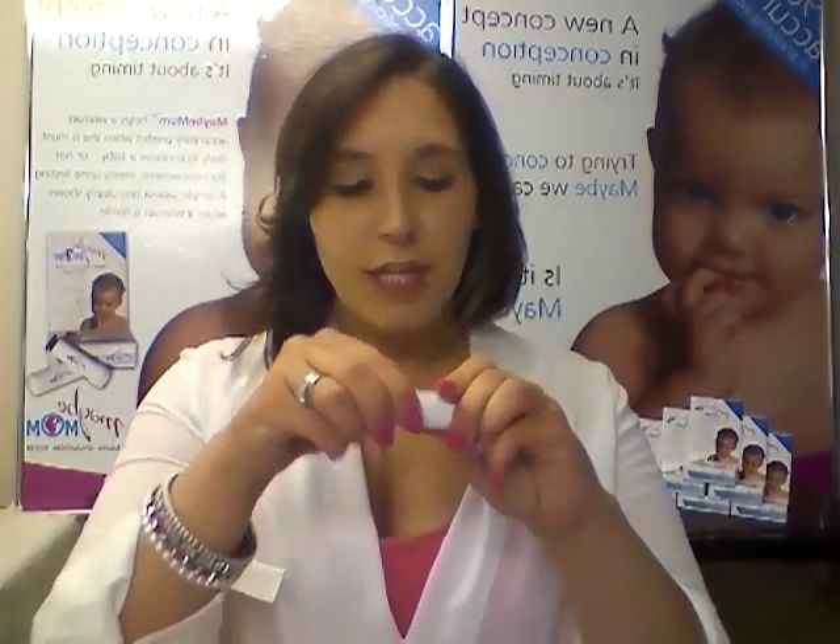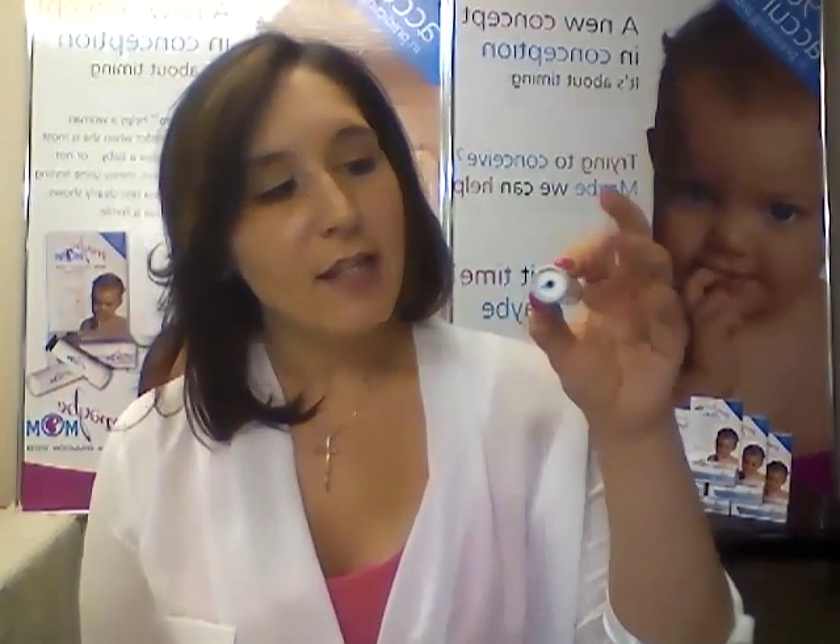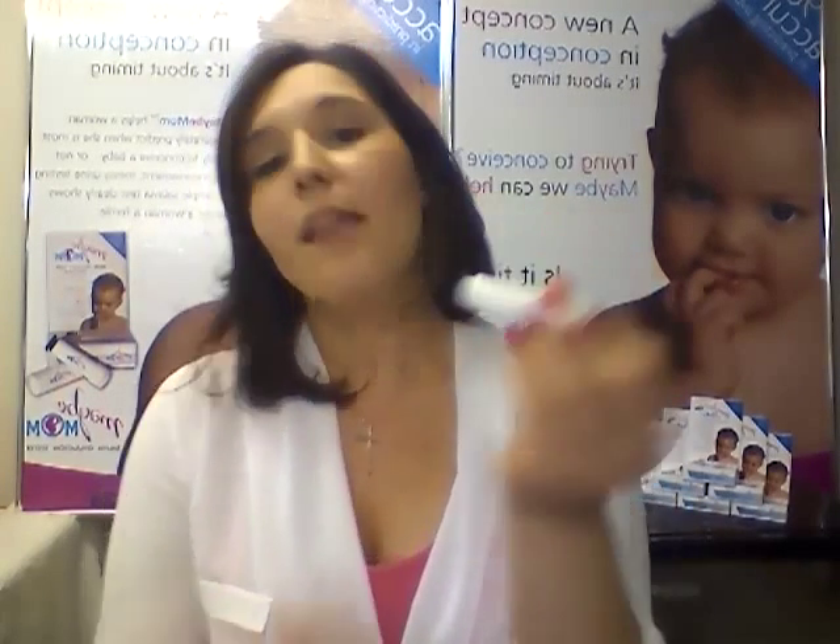What you do is you take the lid off, you take the microscope cap off, you lick your finger and you put your sample of saliva on the microscope lens. You leave that to dry open — it needs about 15 to 20 minutes, and on a cold day could take up to half an hour. But once that's dried completely, you put the cap back on. At the back there's a little button — push that button to illuminate the image with a little LED light and then you hold it up to your eye to view your results.